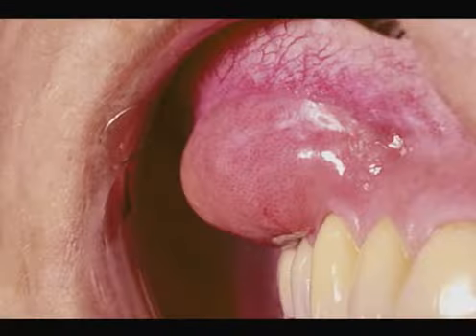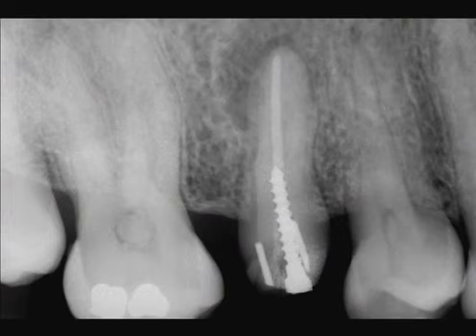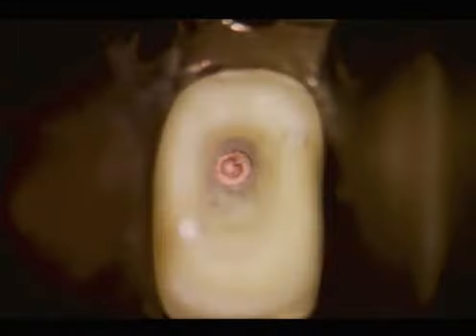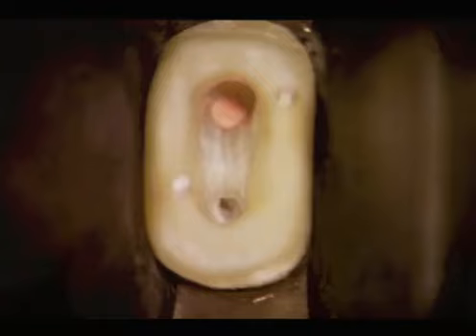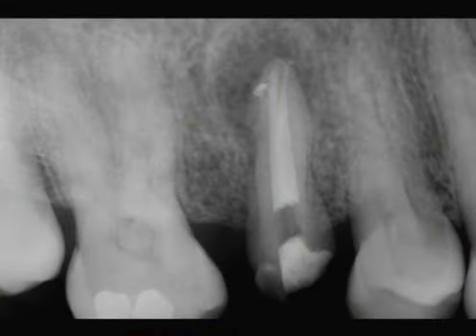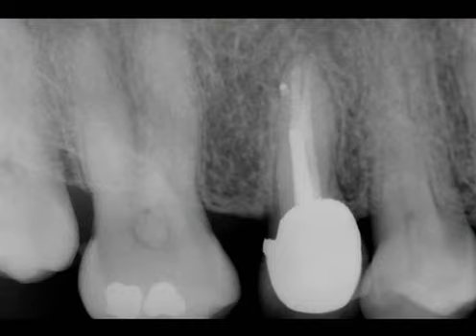Notice the massive swelling in the buccal vestibule. The radiograph reveals incomplete endodontics, and subsequent shows will cover the disassembly effort. When we pull the post out of the buccal system, note that it is skewed off and not centered within the buccal lingual confines of the clinical crown. Moving the access lingual uncovers the lingual orifice. You can see the post-treatment effort and the sealed portals of exit, and the recall at 7 years shows the inevitability of bone fill.